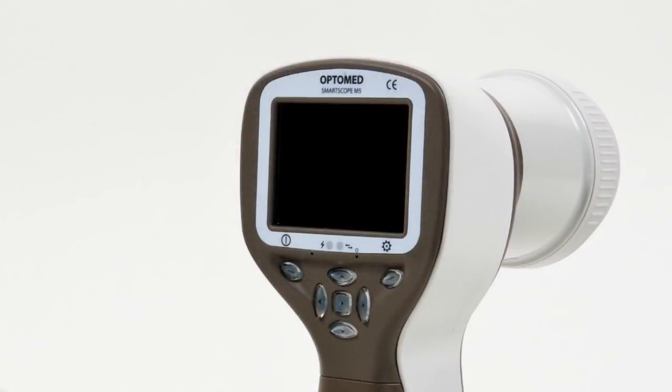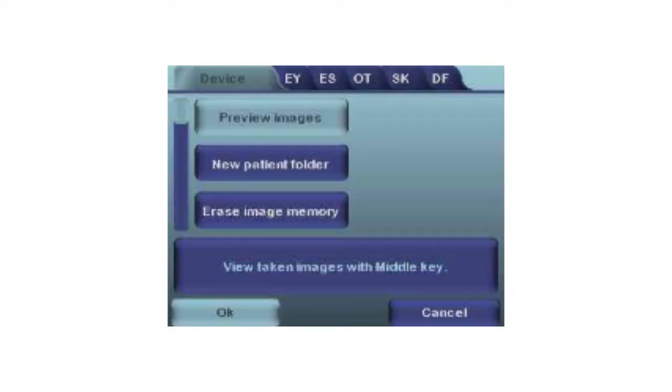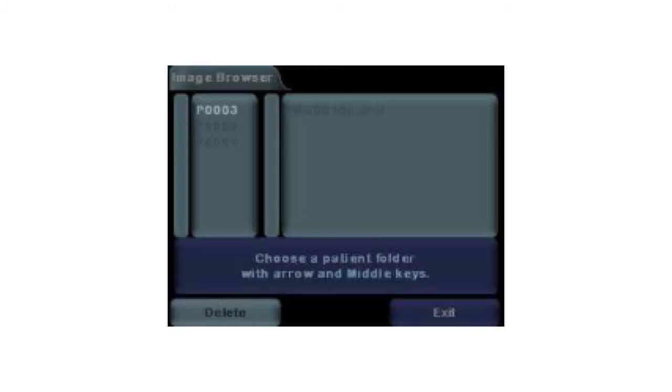Preview. It is possible to preview images on the camera display in thumbnail quality. To preview images, go to the device menu and select preview images.